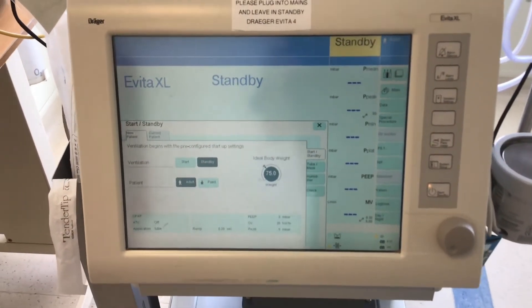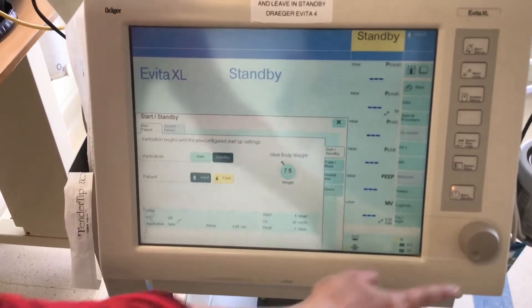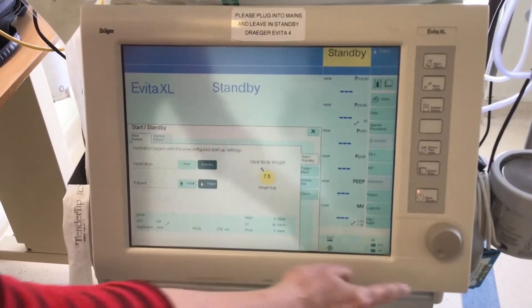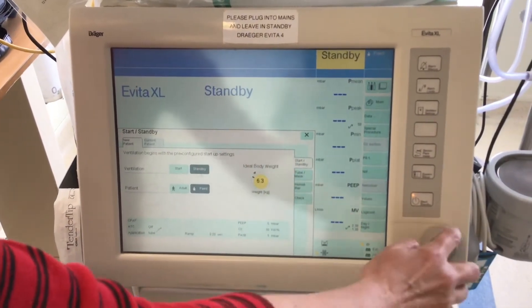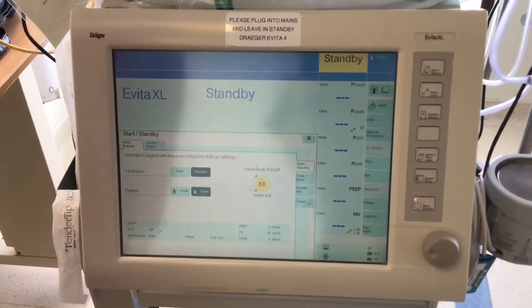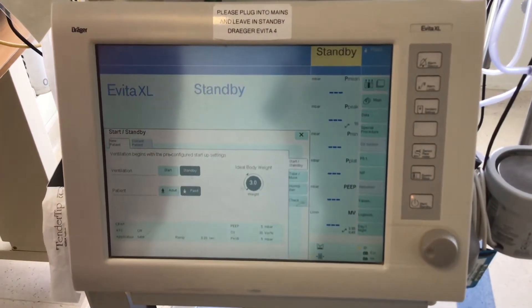On the Evita, go to new patient, press pediatric, and confirm. If you know the ideal body weight, you can fill that in. As you can see, it goes down to three kilograms. Make sure that it says pediatric in the top right-hand corner.